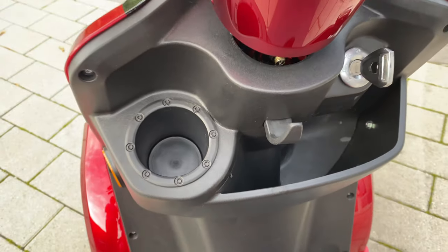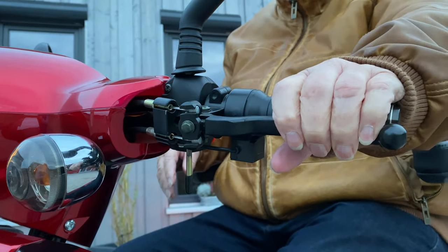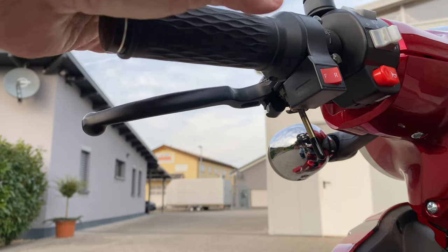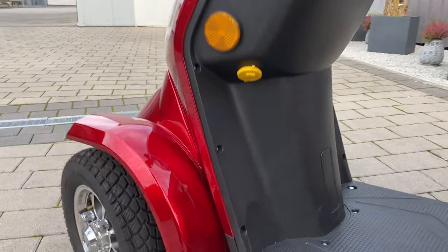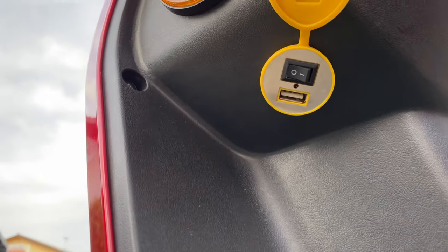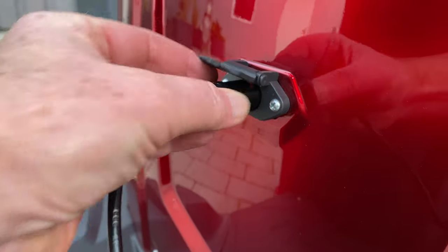There is also a cup holder and a small storage compartment for essentials. A parking brake prevents the vehicle from rolling away when stationary; this can be released simply by briefly pressing the brake lever. The seat back is adjustable to adapt to body size. There is also a switchable USB socket for connecting various devices such as mobile phones. Under the seat, freely accessible, is a charging socket for charging the battery.